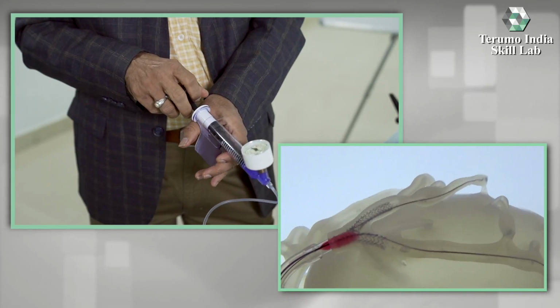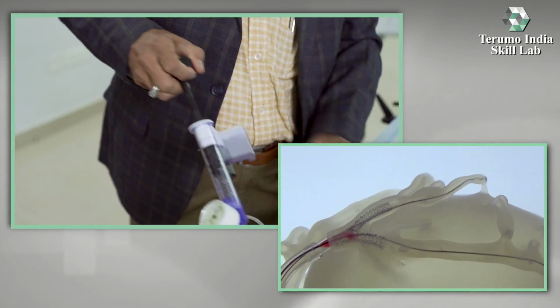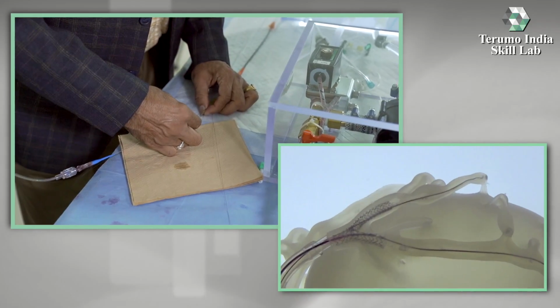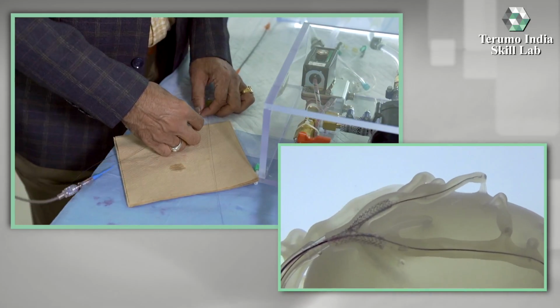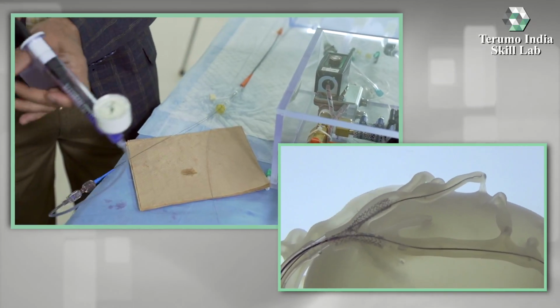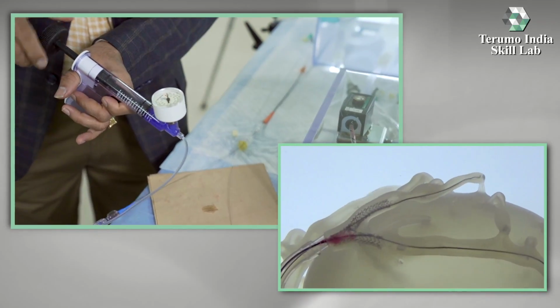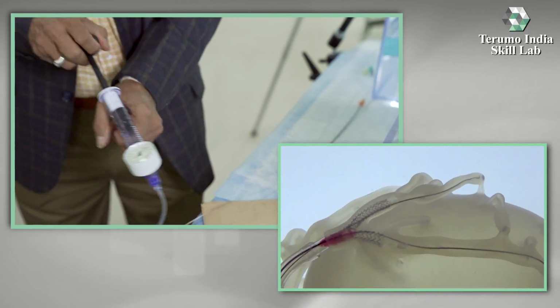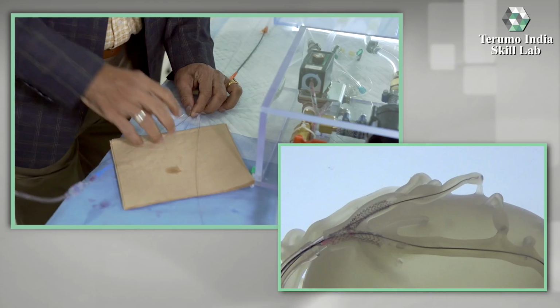The proximal deployment, okay, we go a little beyond. So this is perfect. We go a little more beyond.